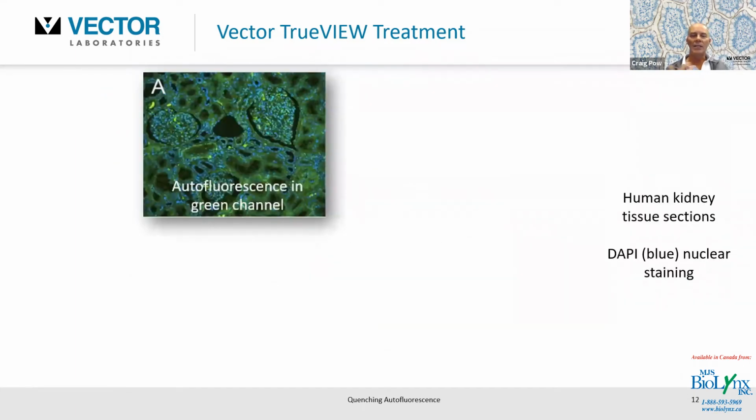All right, a very easy methodology. Reagent A, B, and C, mix them together in that order, and simply apply it to the tissue section for your 2 to 5 minutes. Now, some of you might be thinking out there, okay, but I work in a defined channel, a green or what have you. How does it actually work on some problematic tissues as well under these different spectra?